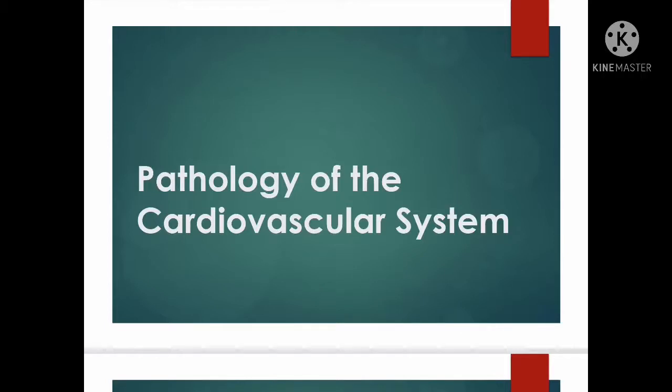Another question for you. For the evaluation of the heart, what chest X-ray projection could be used and why? Is it AP or PA? The answer is chest PA. To minimize the magnification of the heart, which could cause a misinterpretation of the heart size, and because the heart lies anteriorly in the chest, it places the heart closest to the image receptor, therefore it will reduce the magnification. So for the frontal projection, the cardiac silhouette.